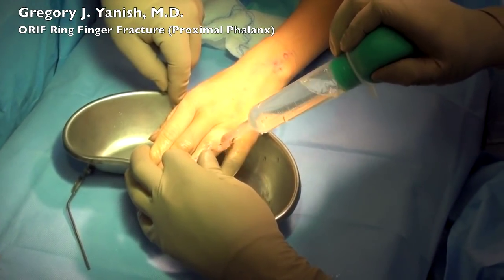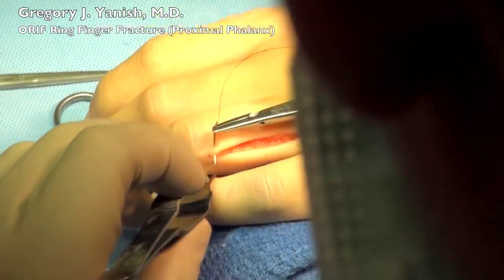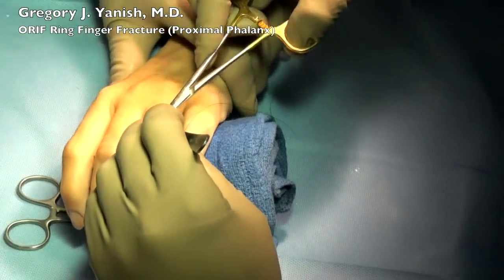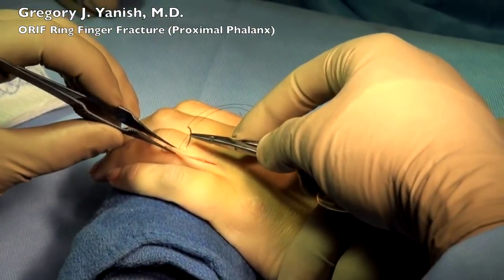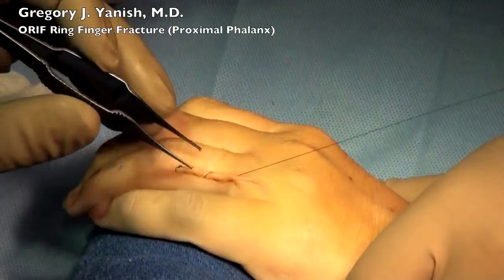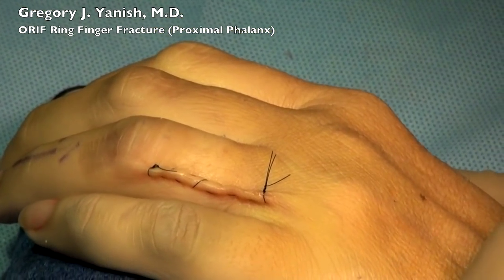The wound is then irrigated with saline and then we'll begin a layered closure. The periosteum was closed over the top of the bone with a 4-0 monocryl suture and now you're seeing the skin closure with a 5-0 nylon. I'm doing a running mattress technique. You'll see me leave a small loop of suture in the middle of the wound which will allow for easier removal — the nurse in the office can clip both ends and one in the middle and pull it out from either direction. You'll also notice that the wound edges are everted, which is done very intentionally and allows for a much better-looking scar.